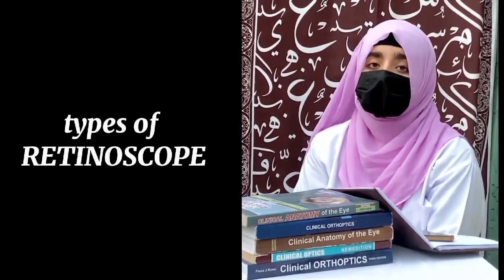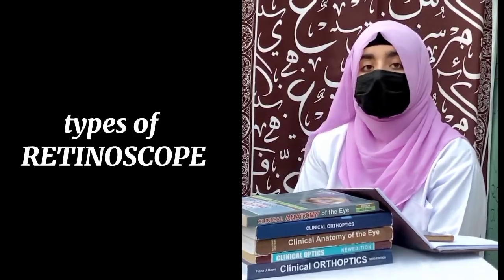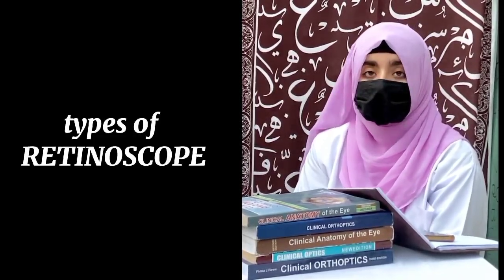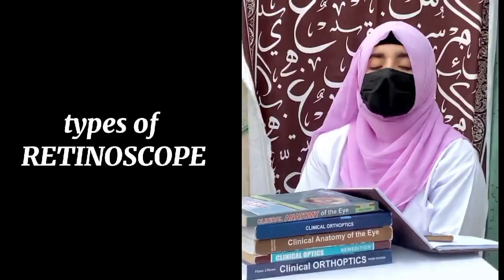There are two types of retinoscope also. The first one is the reflecting mirror retinoscope, which is divided into two types: single plane mirror and plane and concave mirror. The second one is the self-illuminating retinoscope, which is further divided into spot retinoscope and streak retinoscope.